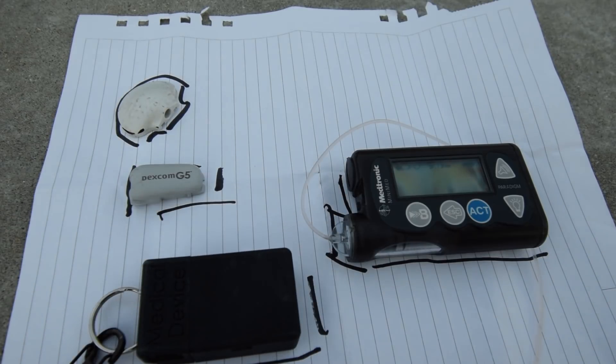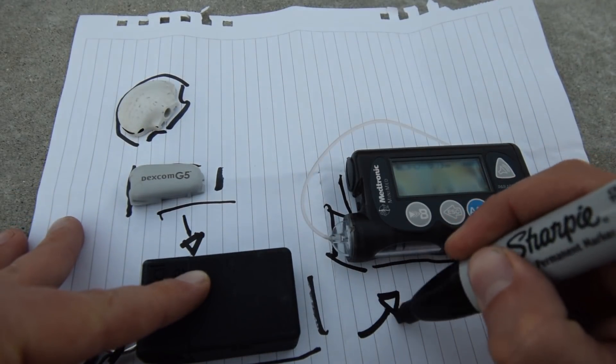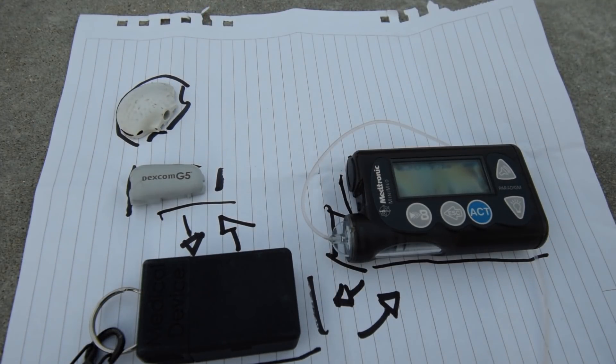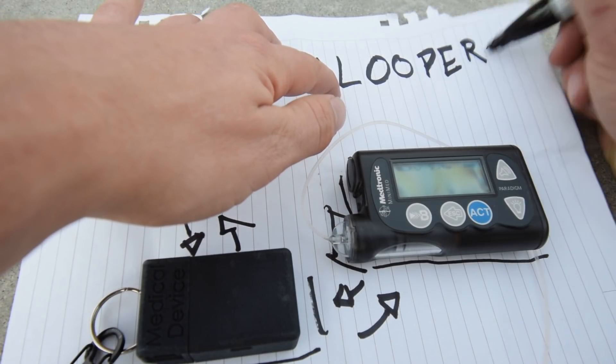That's where the Riley Link comes in. The Riley Link — this piece of equipment — allows the continuous glucose monitor to talk to the pump, and for pump information to be sent back to the continuous glucose monitor. Once this system is set up, this platform, you begin to loop. That is when you're called a looper.